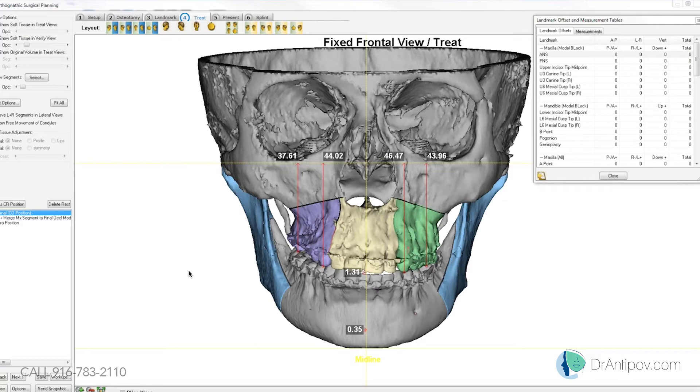So once you correct the cant, the upper part of the midline at the papilla is relatively on the facial midline, and the dental midline at the incisal edge is off about 1 to 1.5 millimeters to the right.